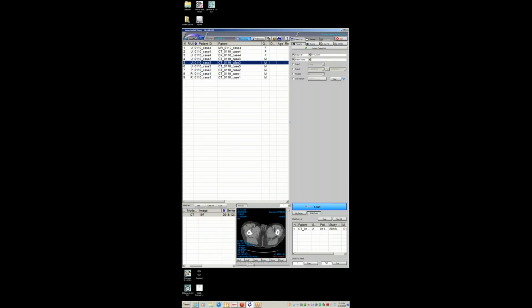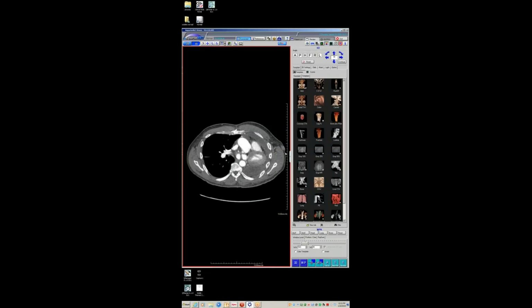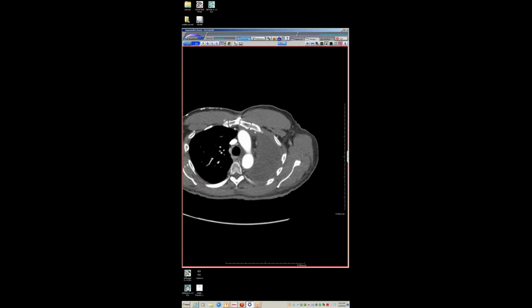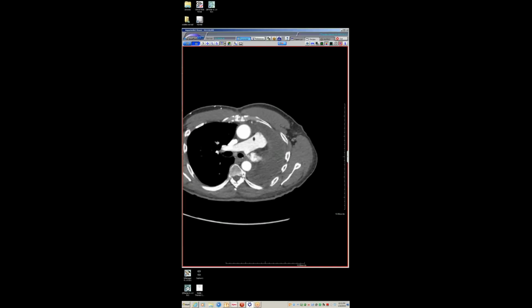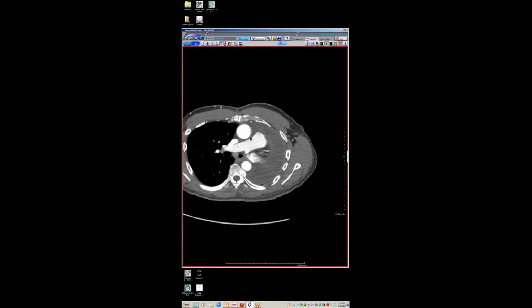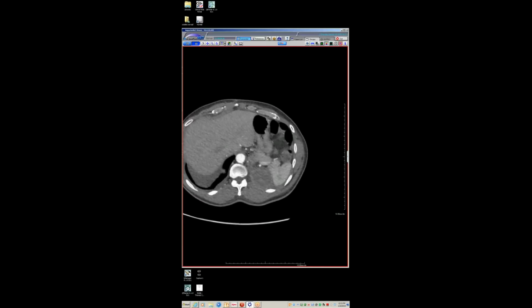This is a bad case. This is something I saw, and I was shocked because, well, I'll show you for various reasons. So here's a guy with a bad tumor. He had a pneumonectomy. He had some sort of sarcoma. I would have to look it up. It wasn't a PA sarcoma. It was just some sort of lower extremity sarcoma.